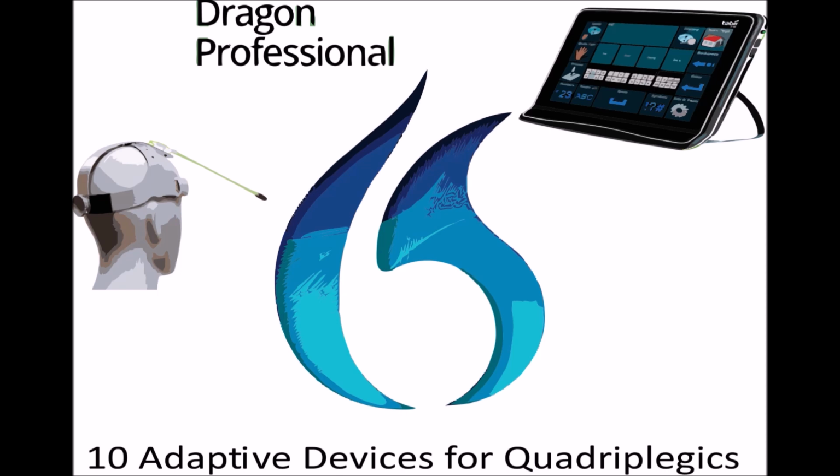face. The individual can move their head in different directions to control the pointer, which can be used to interact with various objects, such as a keyboard, a mouse, or other electronic devices. Head pointers are especially helpful for individuals with spinal cord injuries, muscular dystrophy, cerebral palsy, or other conditions that limit their mobility. They provide these individuals with greater independence and autonomy in their daily lives, allowing them to perform tasks that might otherwise be difficult or impossible.